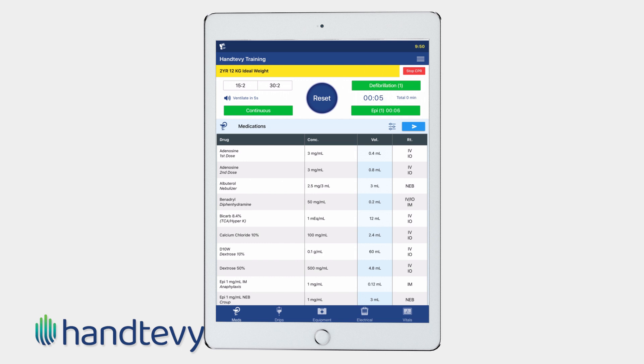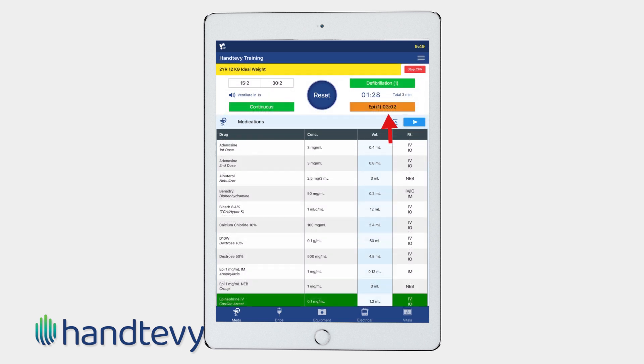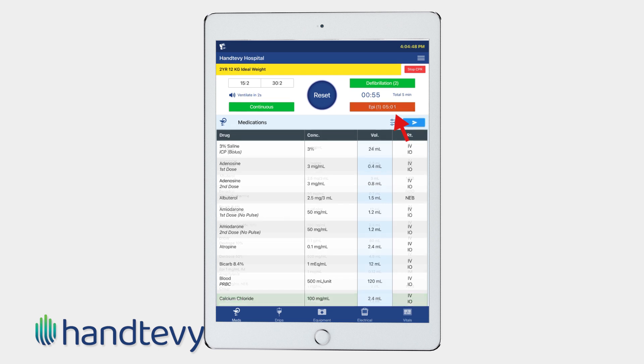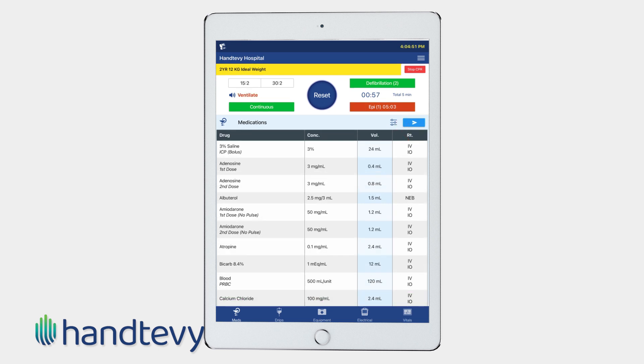An additional feature on the epinephrine timer is that the button turns orange at three minutes, and at five minutes it will turn red. The timer resets once epinephrine is administered.